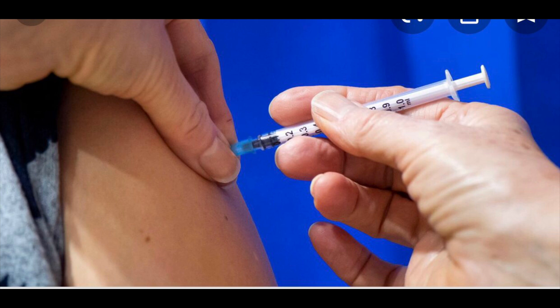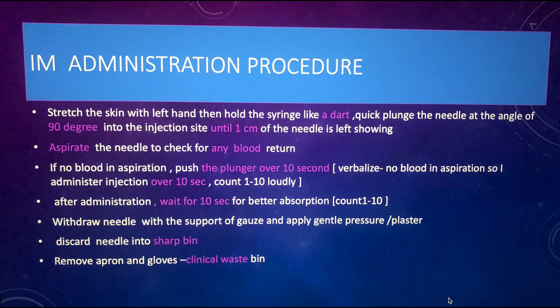After administration, wait 10 seconds, then withdraw the needle and apply gentle pressure with the gauze. Apply a plaster if appropriate, first confirming the patient has no plaster allergy. If there is no active bleeding and the skin is intact, you may verbalize that you are happy to leave it without a plaster. Discard the needle into the sharps bin immediately.